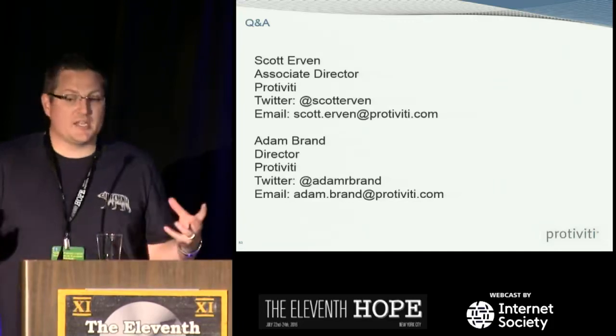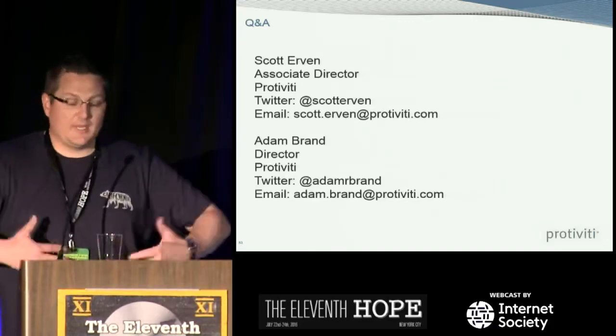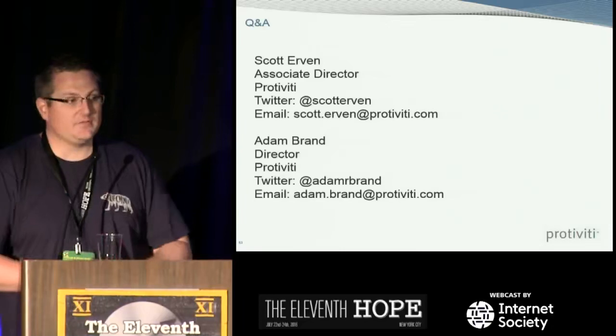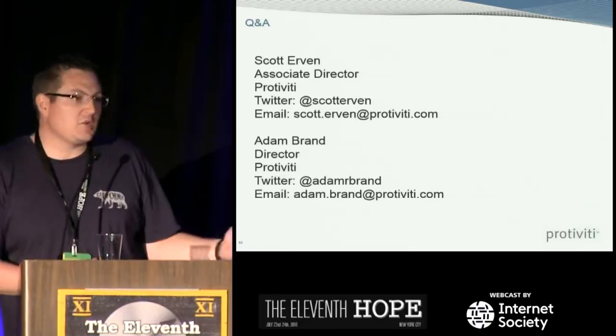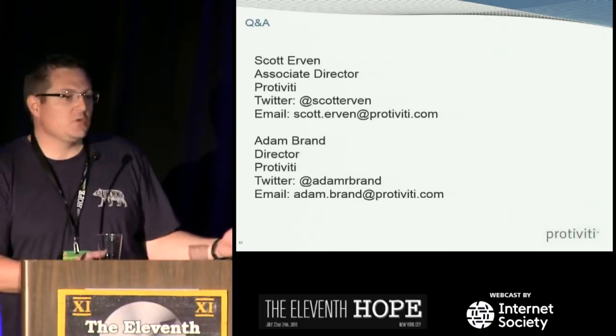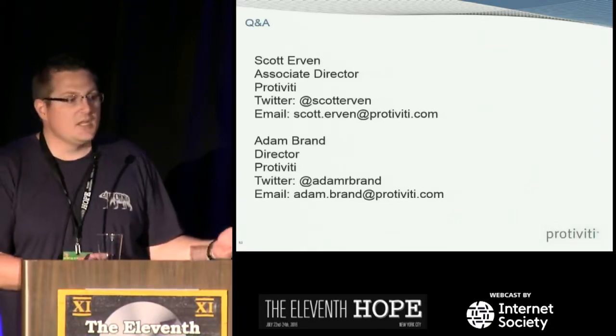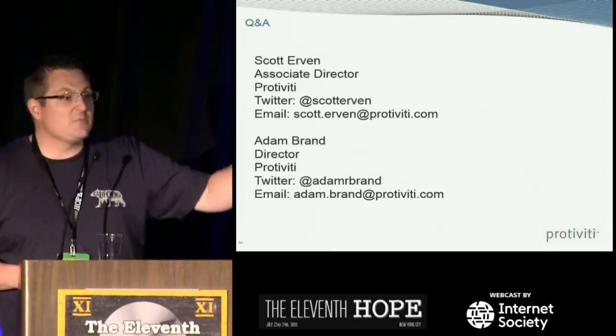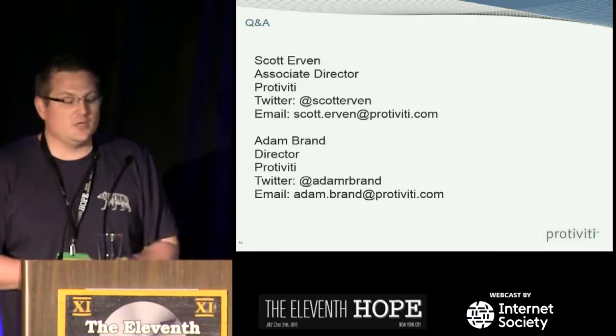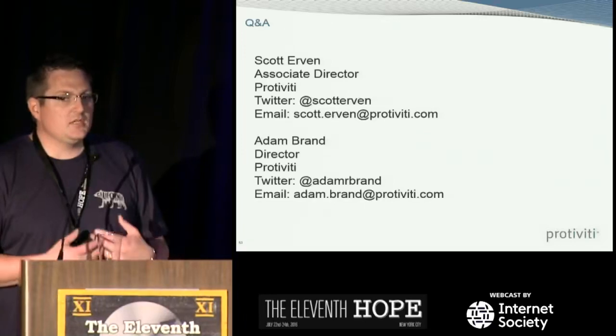So you have secure design, right? And the focus right now, even from the FDA, has been putting pressure on the manufacturers. And oftentimes the providers, the healthcare systems say, well, it's the manufacturers, it's their problem. We're going to sit on our butts and we don't need to do anything until they secure these devices. But as we've shown, like with that Shodan stuff, that was actually the hospital's fault for implementing it in an insecure fashion. So there's certain things that you need to do.